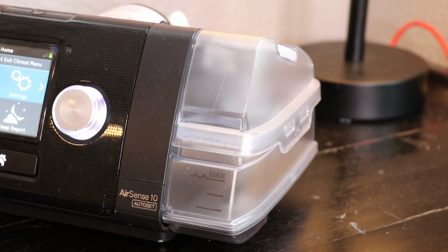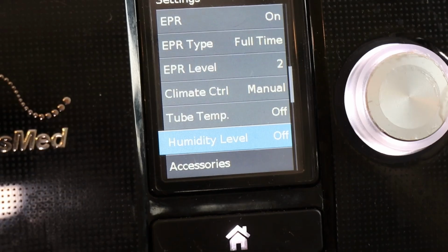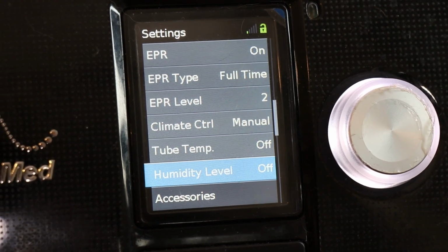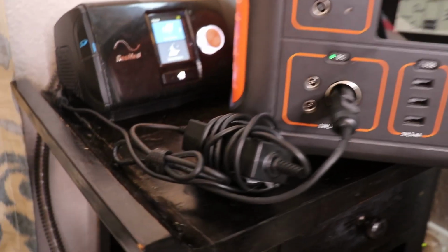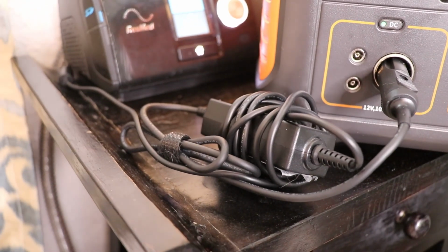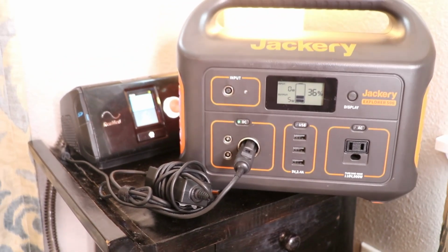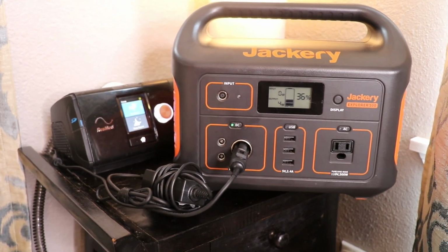Yeah, you'll have to sleep with your CPAP machine without the nice heated water that you normally get from the humidifier, but you are now going to be able to run it for around 10 to 12 days using the Jackery Explorer 500. With this setup, I found that you lose around 1.25% of the power per hour. And the battery runs much more efficiently for the first 24 hours, where you'll lose around 1% per hour.